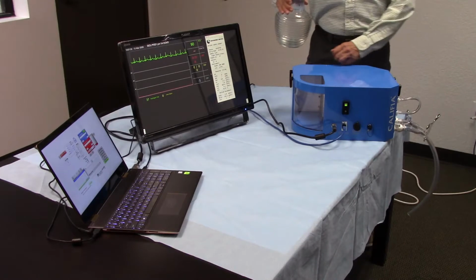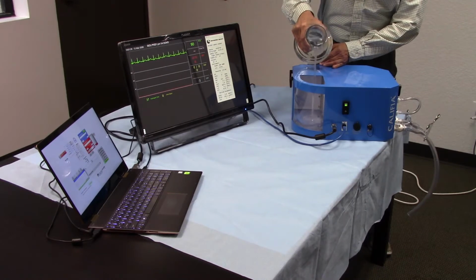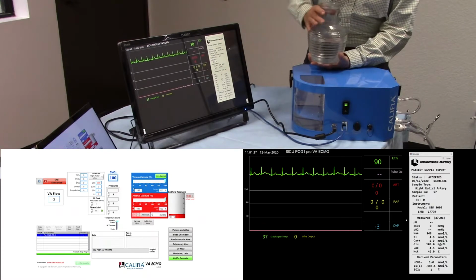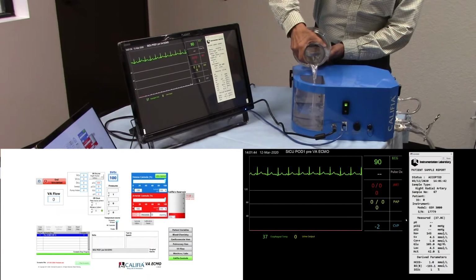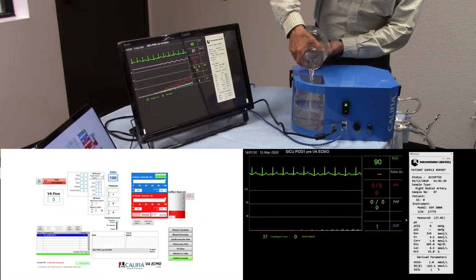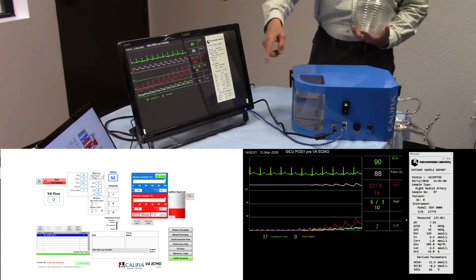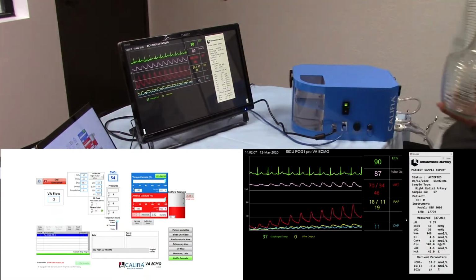What we're going to do now is we're going to fill Califia with our overfilled. And we're going to shoot for 12. And I might go ahead and stop here and point out the fact that the CVP now is starting to respond to this filling. As I put more and more fluid into Califia, the CVP rises. I'm going to be shooting for something close to 12. This might actually be just the right amount of water, to tell you the truth. So now I'm going to be very close to 12 centimeters of water, and you'll also notice that the other screen is also showing the volume that's in Califia.